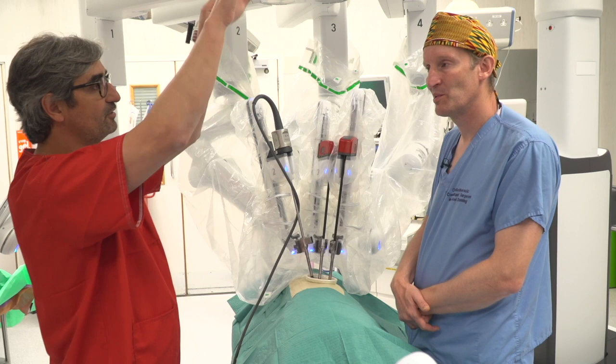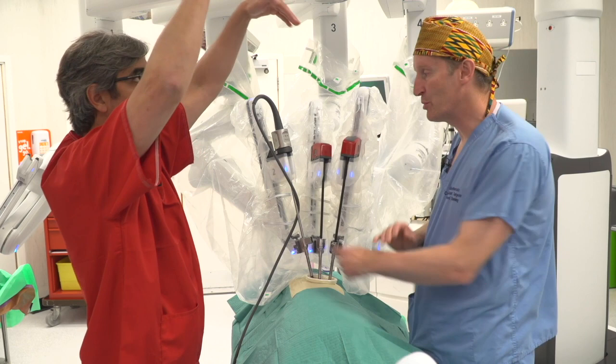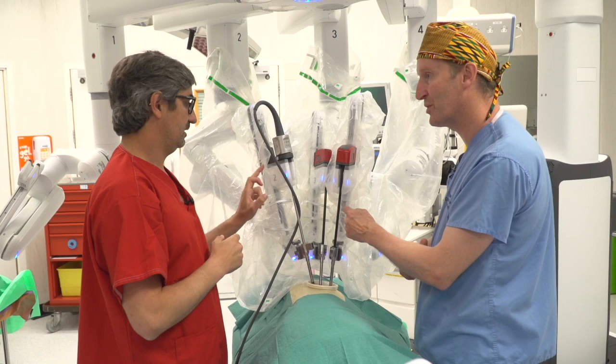So in that moment, you change the movements completely. That means the camera is 30 up, so the arms will be here. And then you can remove all the additions easily. But do you change this to the fourth arm? We change this up, that's it. Just up, all right. That's it.